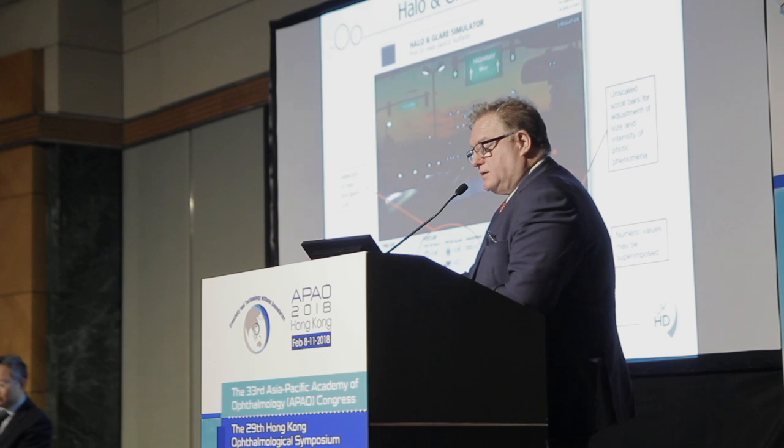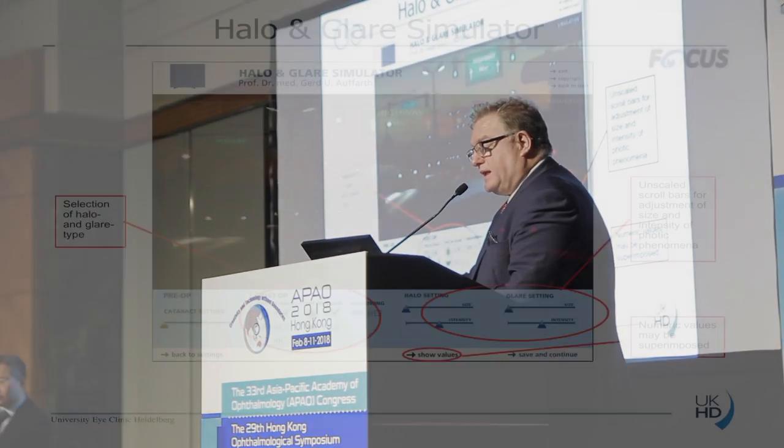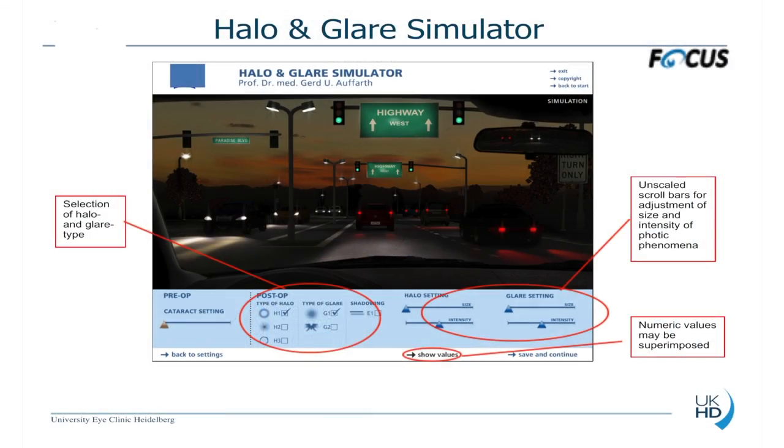If you look at this in detail, the program offers you to differentiate between classical halo, which is called H1, so-called starburst type halos, which is H2, or some kind of fuzzy rounded halos, which is H3. And also the types of glare is like this type of glare here, or these kind of shadow images. This is G1, G2. And apart from this, you can also do the size and the intensity of the side effects. And this is applicable for halo as well as for glare. So there's a lot of things you can look into here.